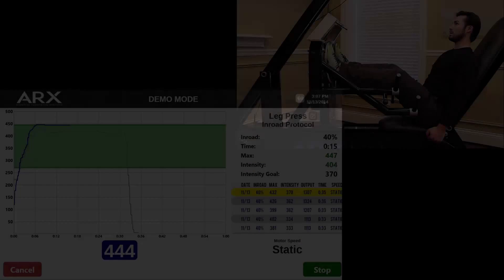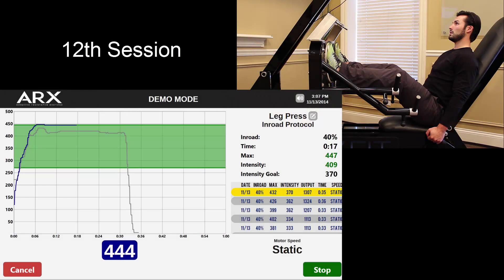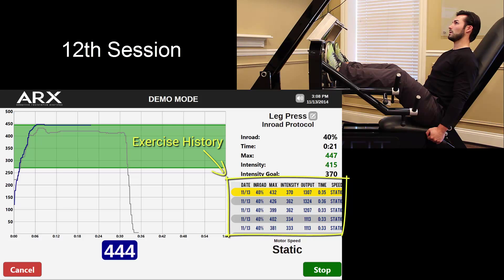Fast forward to his 12th session — it's been a couple of months. The patient's progress has been tracked each week within the software. His data has been compiled and is displayed in a table in the lower right-hand section of the screen. Every set he's ever done is accounted for; we've saved everything.